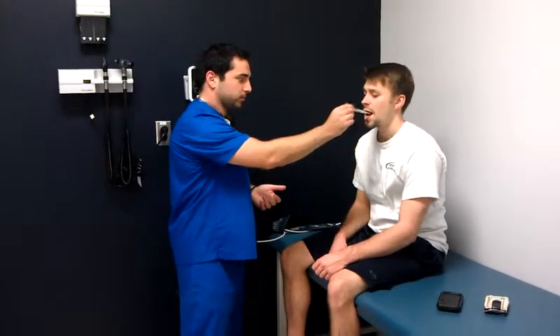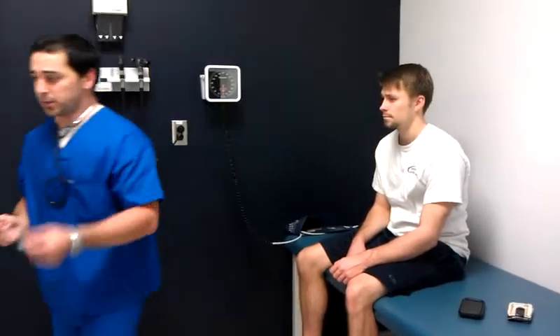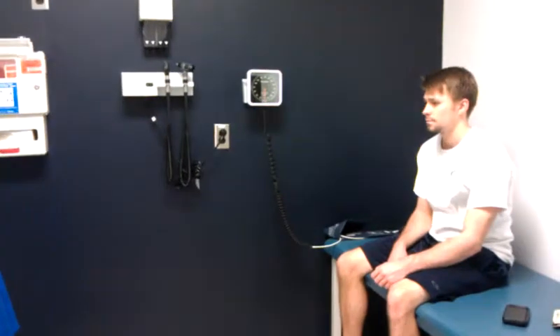May I take this out? Okay, we have our result now. It's 98.5, which happens to be normal. Normal range is 96.5 to 99.5. Properly disposed, place it back in the sheath case.